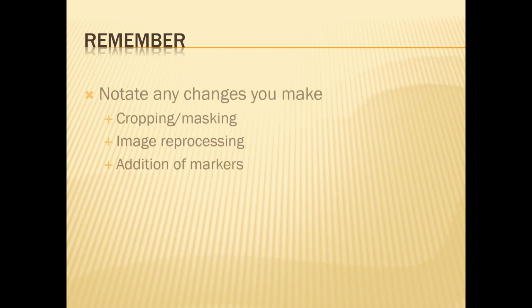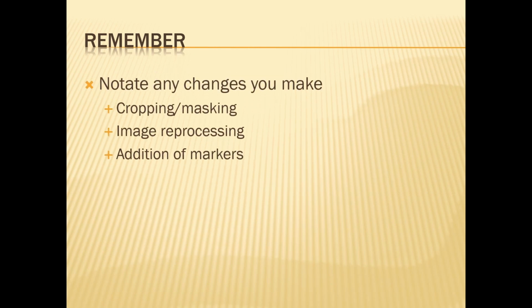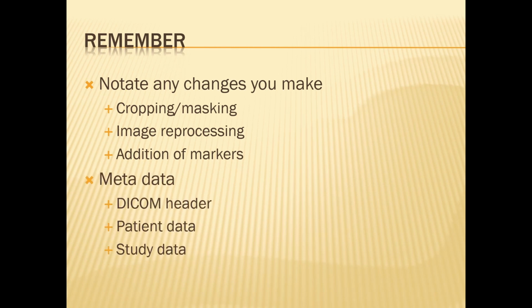It is important to remember that you must document any image manipulation performed, no matter how small, on the image before submitting to PACS. You don't want to be accused of trying to hide shoddy work by post-processing the image. There is metadata attached to every image you produce in the form of a DICOM header. The DICOM header may contain not only patient information, like the patient's name and exam date, but also study data such as collimator size, central ray location, KVP, and MAS used to produce the image.